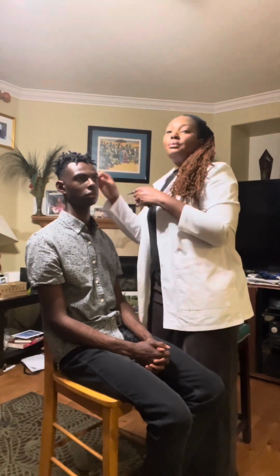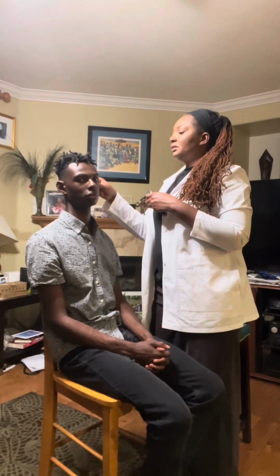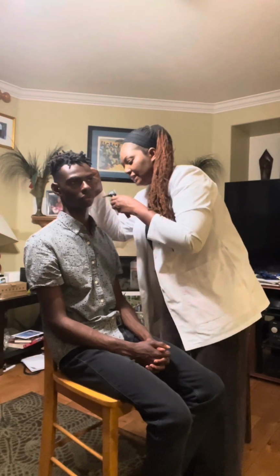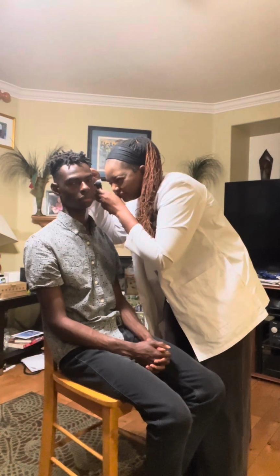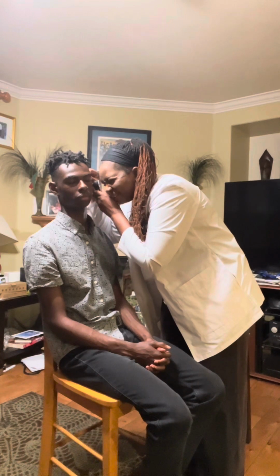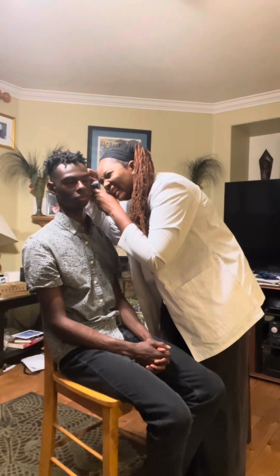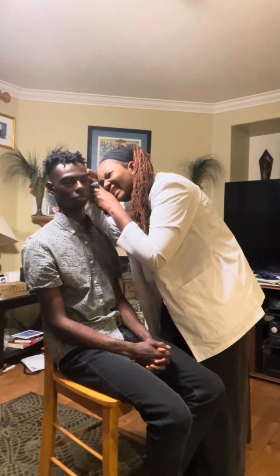With an adult patient, you will pull up and back and look, but with kids, you will pull down and back. Okay, so in the right ear, with the light, you go to 5 o'clock, and the tympanic membrane is fairly gray, and I don't see any sign of redness. There's no erythema, there is no drainage.